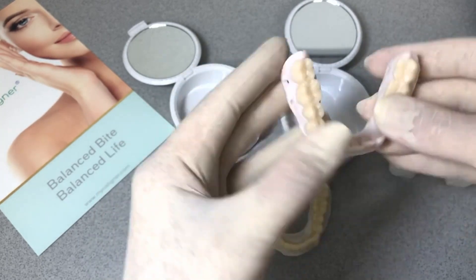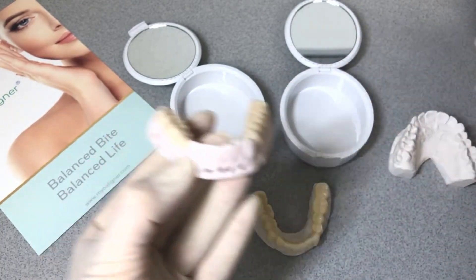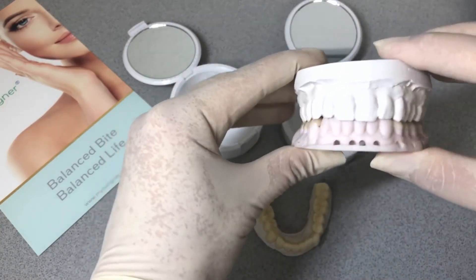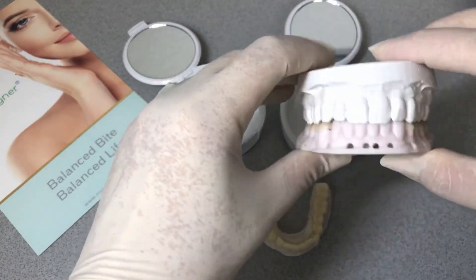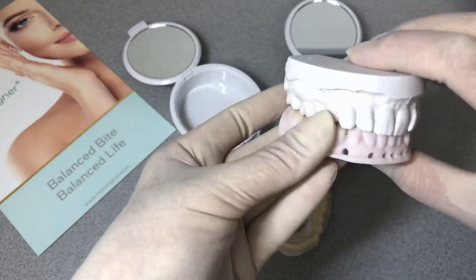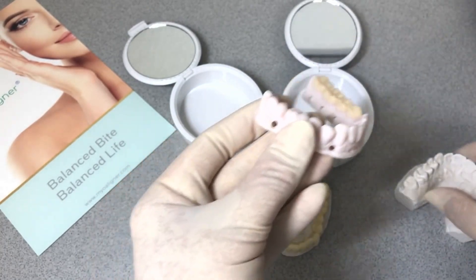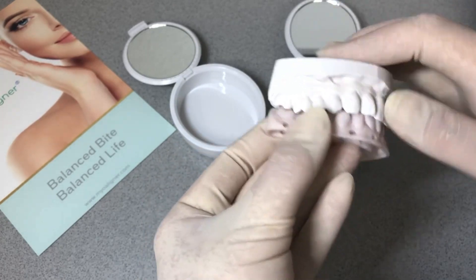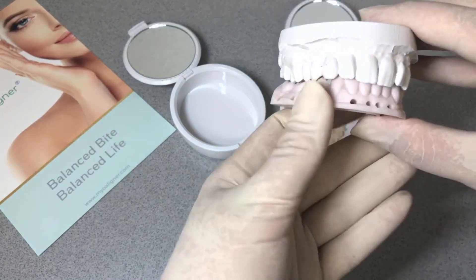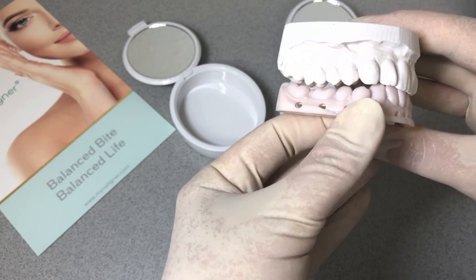An orthodontist can segment these and, while maintaining the mandibular position, maybe expand the upper jaw, expand and improve the plane of occlusion while they're maintaining the mandibular position. If I remove this piece, you can see that interocclusal gap that is needed to close.